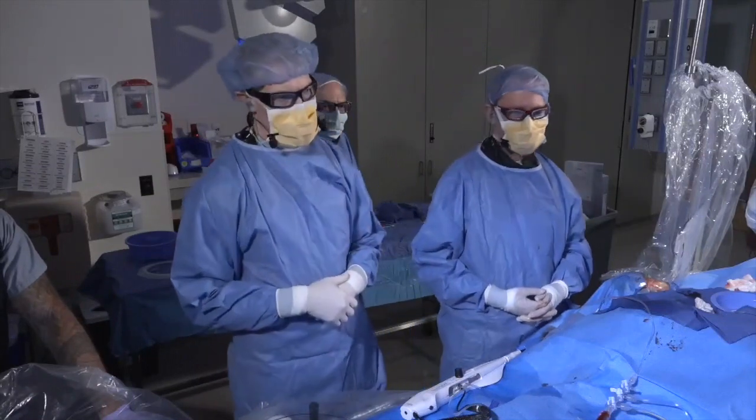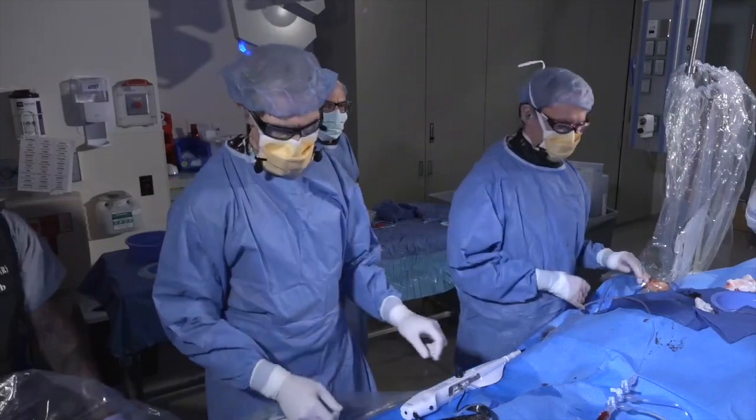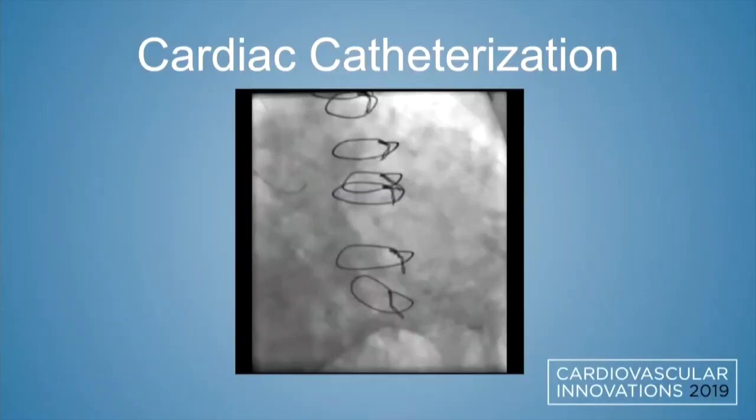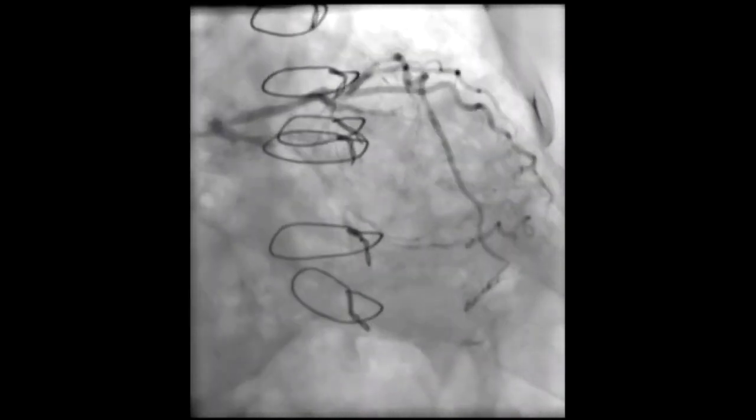Yeah, I think we're going to let you guys keep going because I know you have to work and there's limited time, but we'll talk more about that as you're doing your work. So you treated the right. Did you need atherectomy on the right? Go ahead. So, well, we did it. Yeah, why don't you keep going with the PowerPoint.